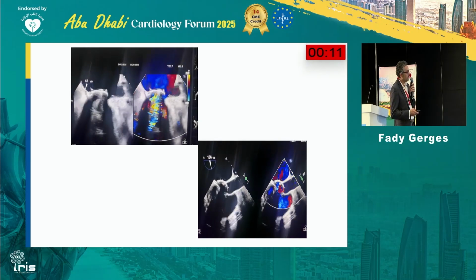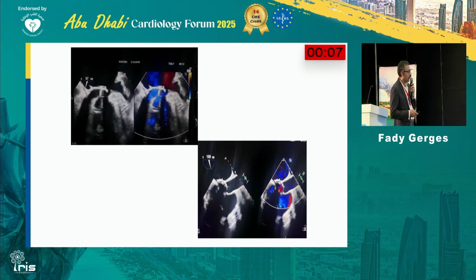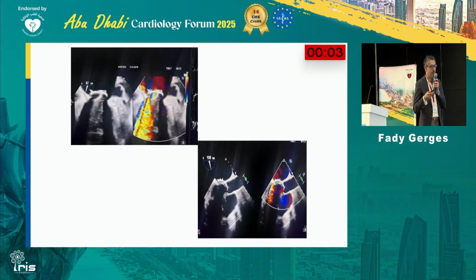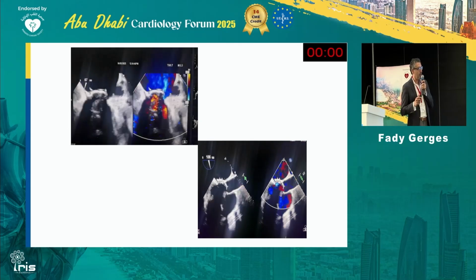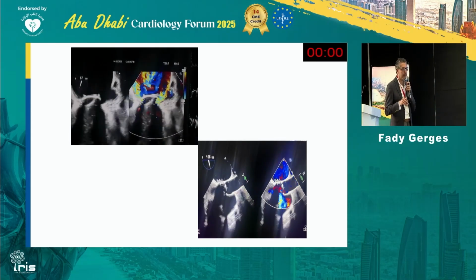However, the patient was anesthetized. We give midazolam, fentanyl, very light doses. I usually give the sedation myself. I don't like to knock the patient to sleep because I'd like the patient to be a little bit conscious, to be able to swallow the probe properly. And I don't want to play with the hemodynamics as well. So deep sedation is not really a good idea during TEE.